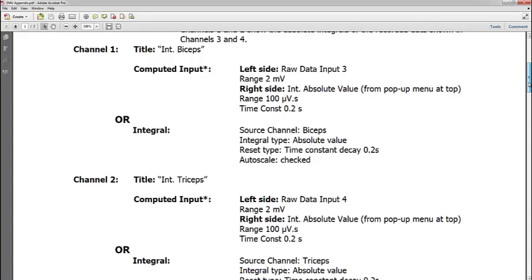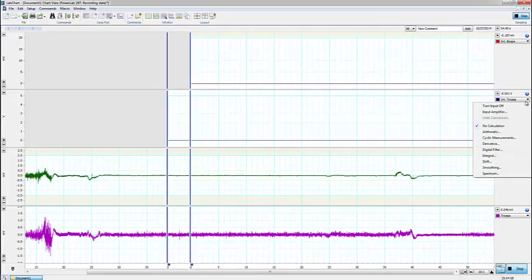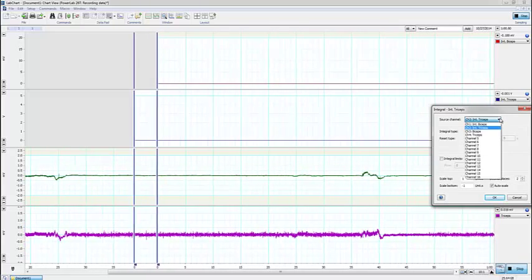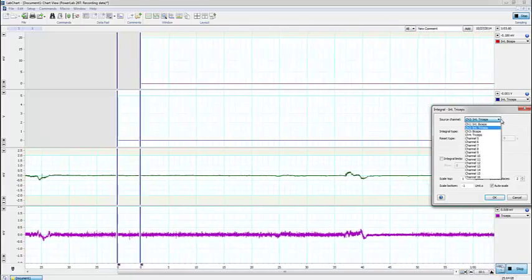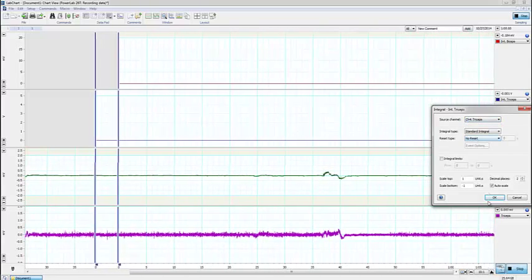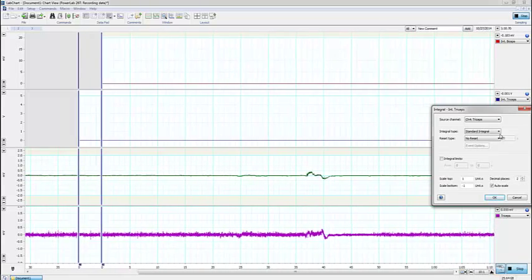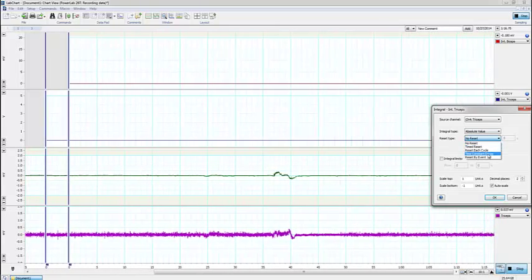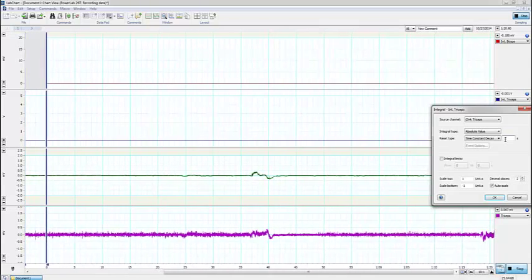Take note of what we're doing: you want to know which the raw inputs are, and you're also going to want to know what kind of integral to choose. We're going to choose absolute value and set the time constant as well. I minimize the appendix and come back to the drop-down menu for the integral. A couple of things: first, the source channel — we're setting up the triceps right now, so we want the raw triceps channel. I click absolute value, then time constant decay.